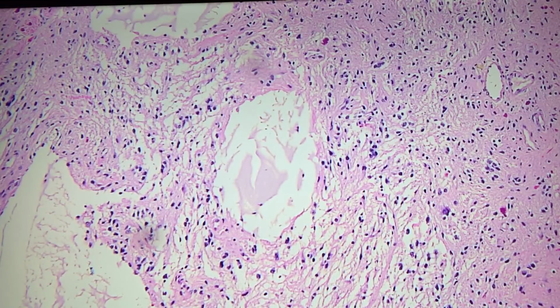These little microcysts are also pretty characteristic, right? These almost degenerated areas, like you might get in a ganglion cyst of the soft tissue. It just kind of breaks down, those looser glial areas. Yeah, classic. This is very important for the boards. They ask you because you're supposed to know classic tumors like this.